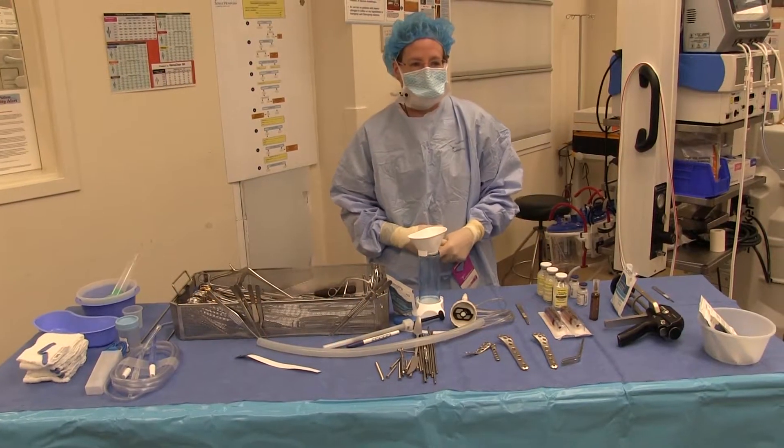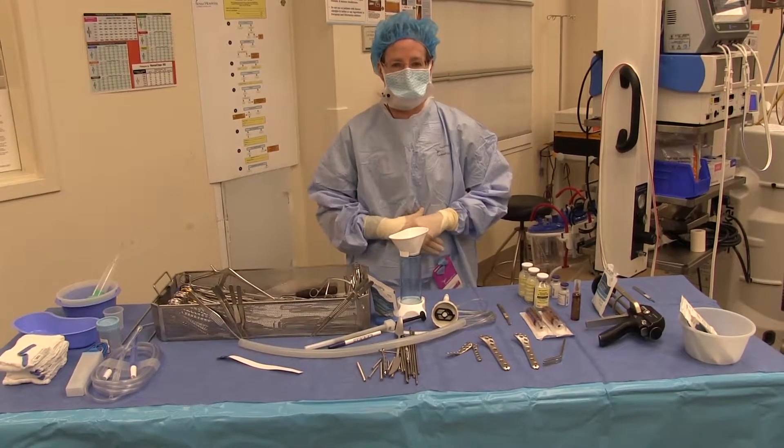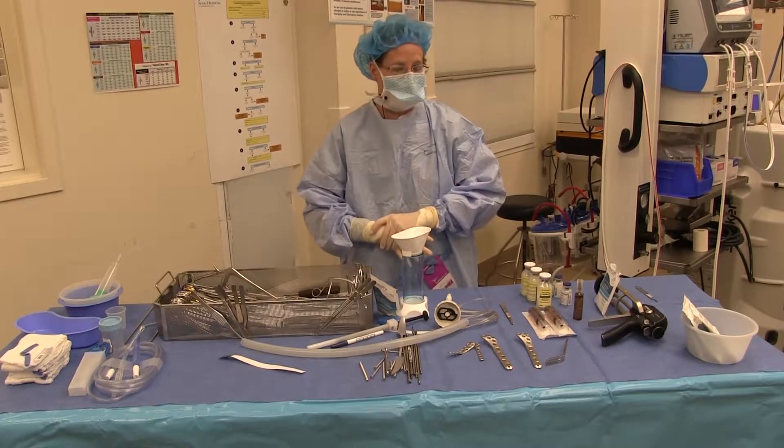Hi, my name is Dr. Janet Conway, and I practice at the Rubin Institute. I am going to show you how to make some antibiotic coated plates today.